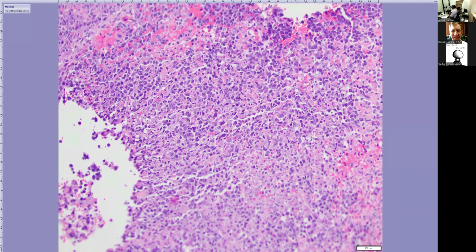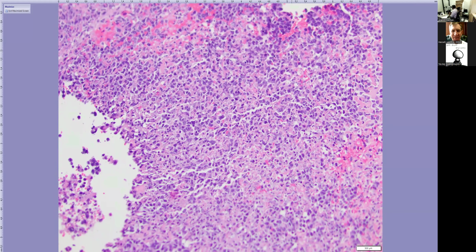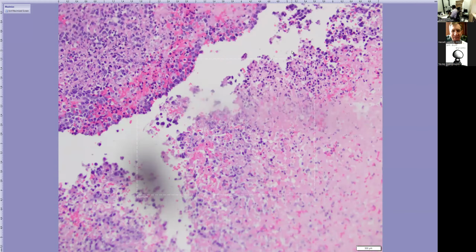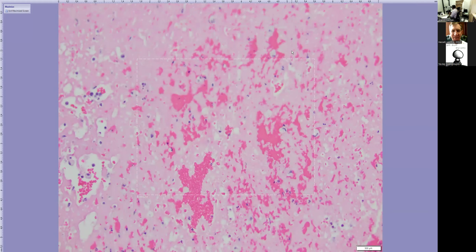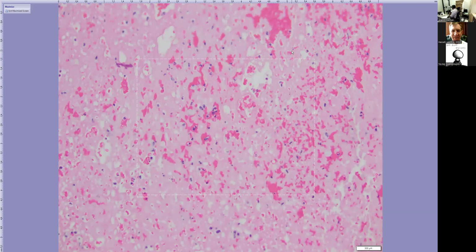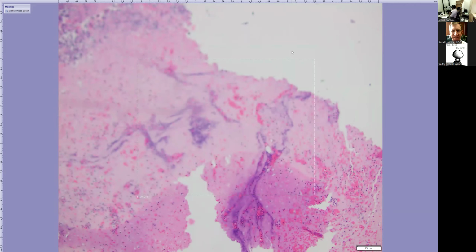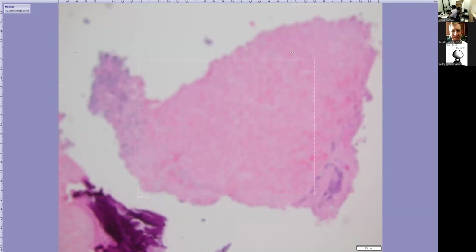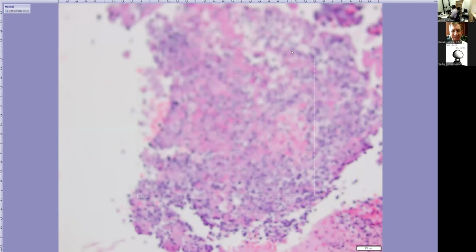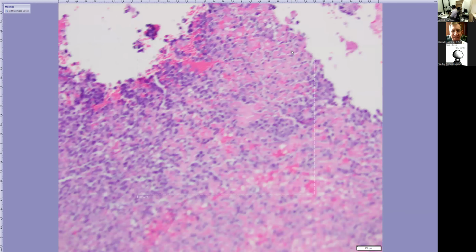This was completely an incidental finding. They did not go after any lesion. So it was just noted on this aortic valve when it was submitted for routine pathology. So you have these foci where there's this fibrin/acellular material, maybe some hemorrhage. And then there are some foci with necrosis as well. Again, you have this kind of acellular fibrinous material. And then these cells, which cytologically look very scary, were present in this tissue.